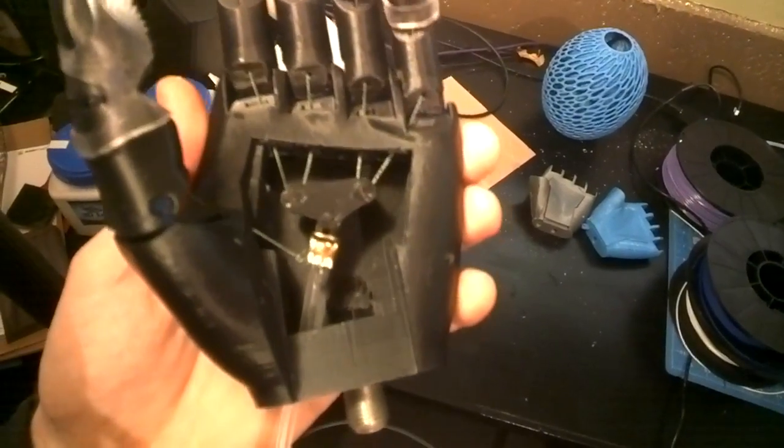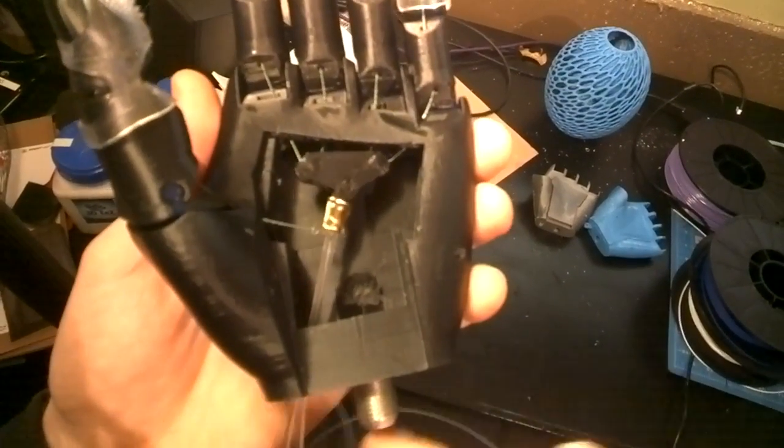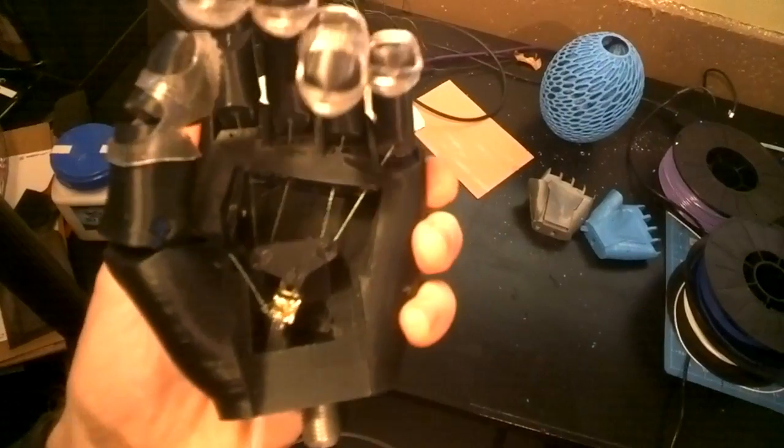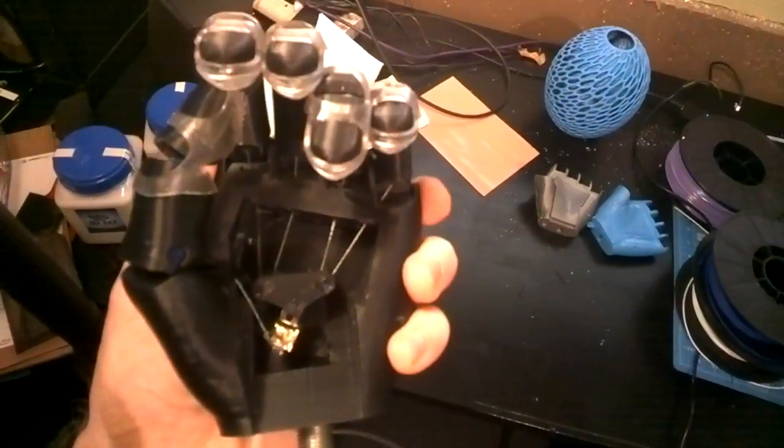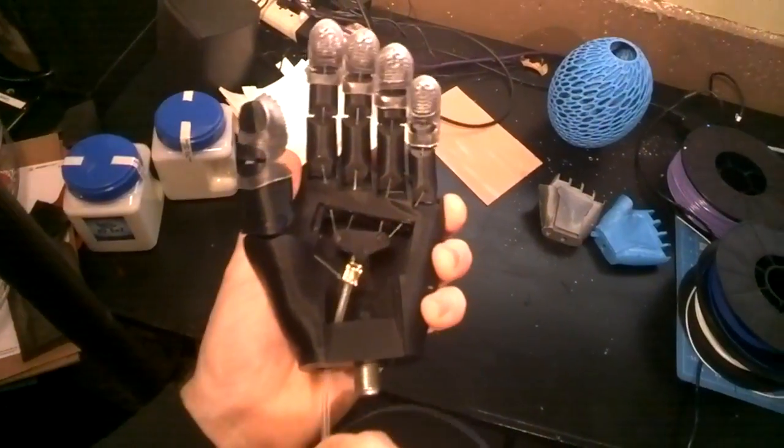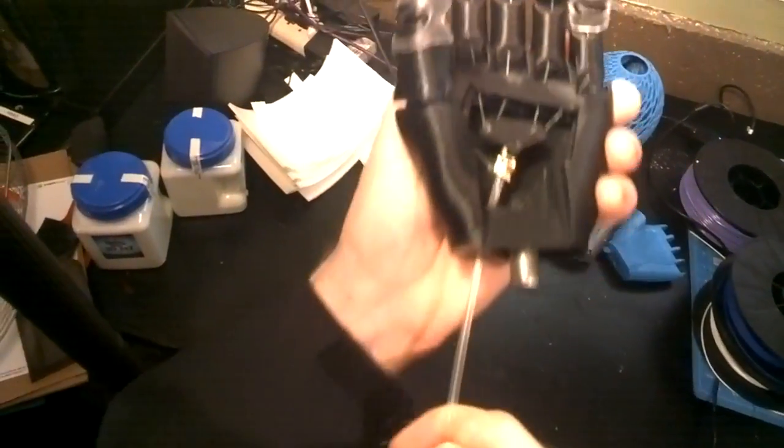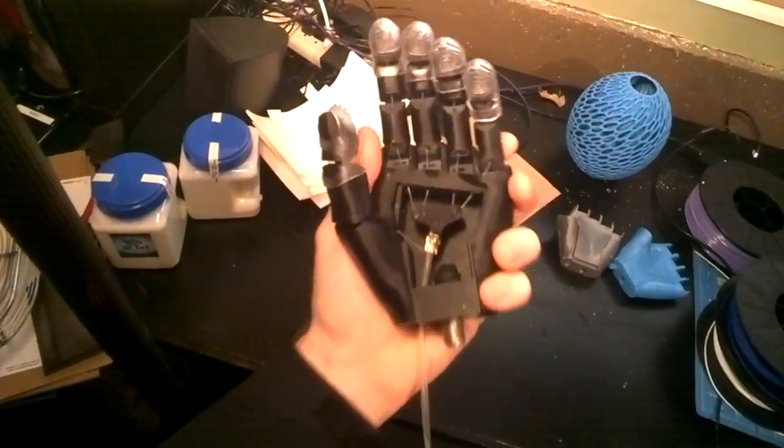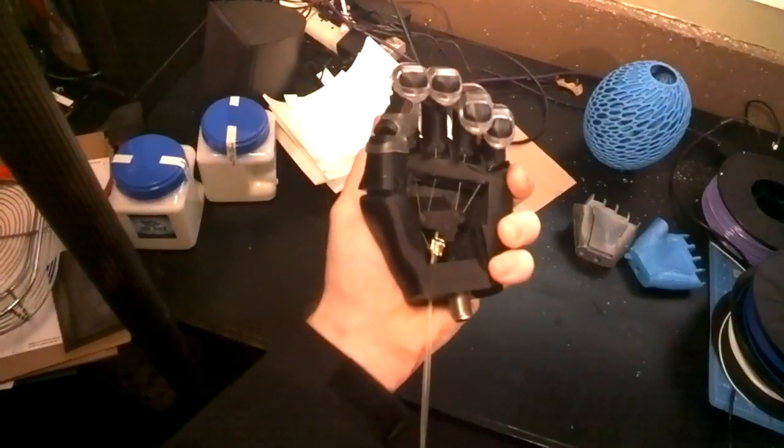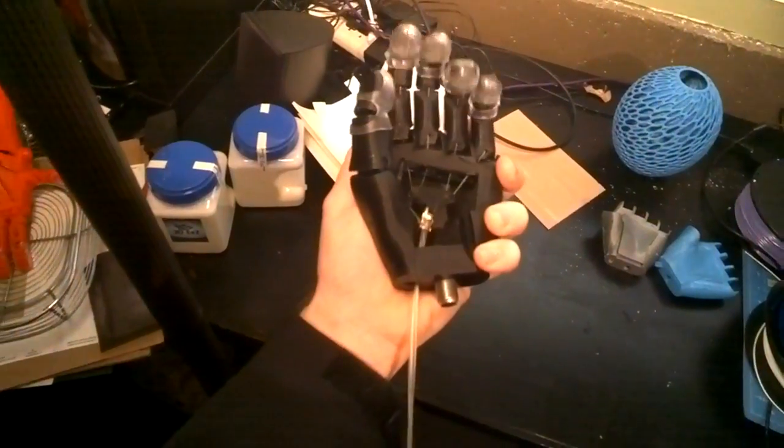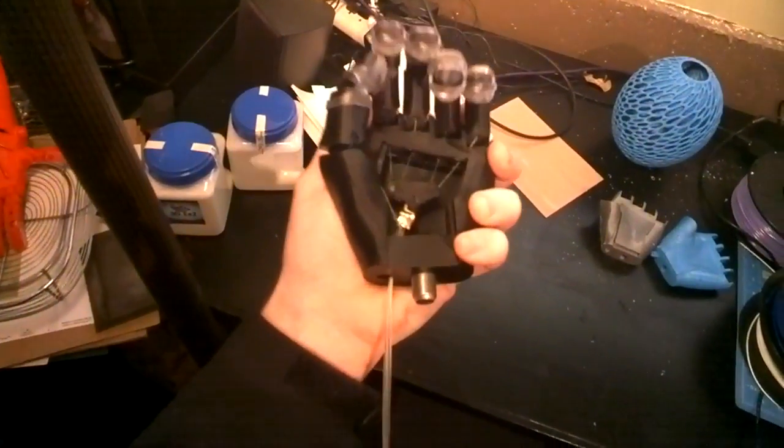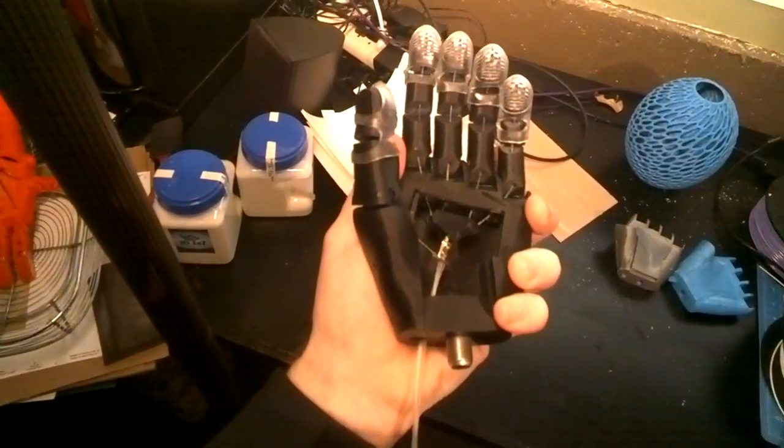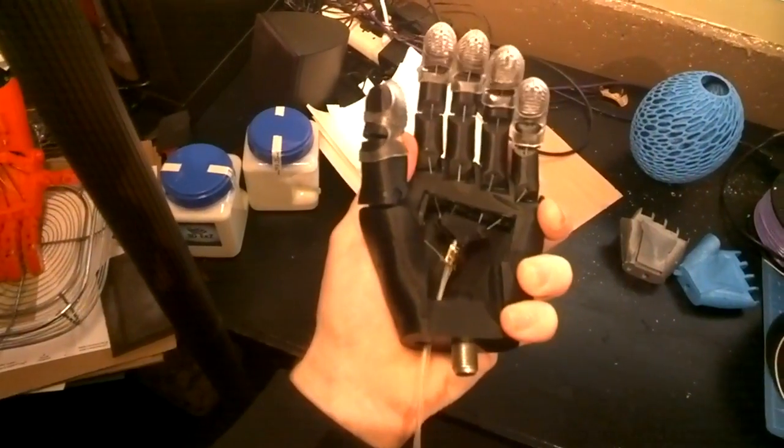you can see a Whipple Tree mechanism to allow for variable grasping. You can see how that works there. It's connected via a line of bridge nylon and allows you to operate the fingers by pulling on the one line which would be attached through a Bowden tube to a harness mechanism.